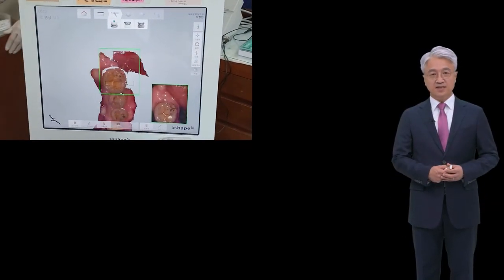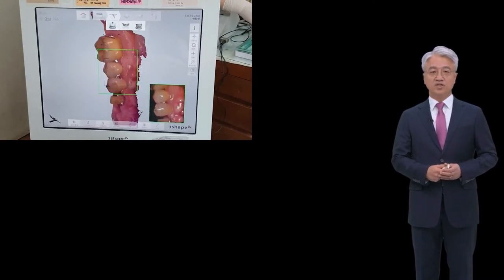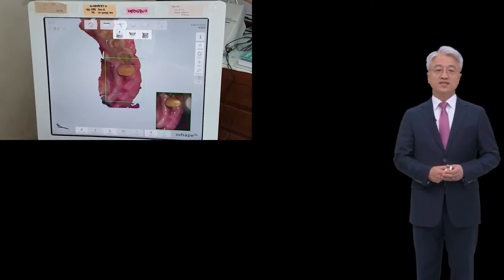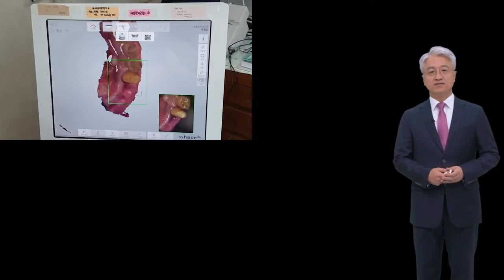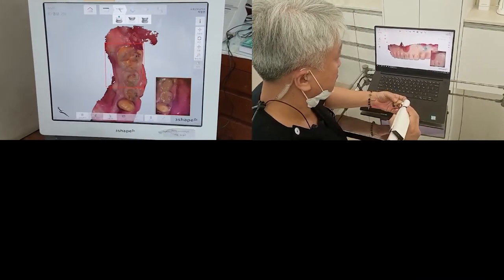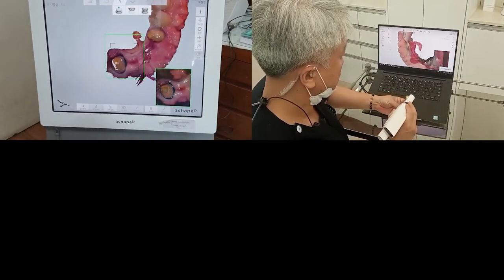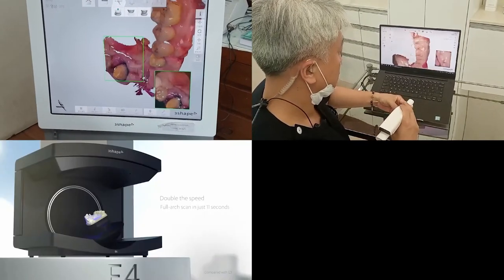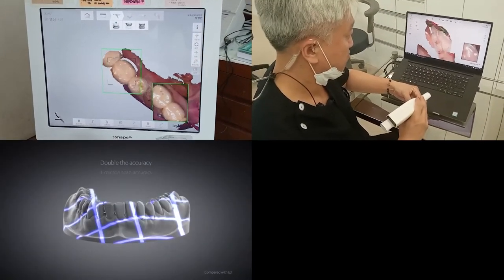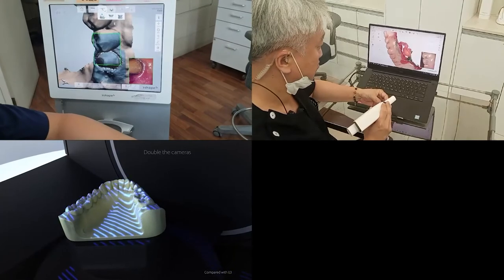Intraoral scan is used to take oral scan. On computer, all kind of work is done. You can proceed with prosthodontic steps with modulus. You can also utilize it for surgery and orthodontic treatment as well. Using intraoral scanner, you can scan the patient's denture or recording base extraorally. In the case of full mouth cases, using intraoral scan, there can be a lot of error. Therefore, you can use a table scanner and scan the model for full mouth cases. And that is preferred these days.